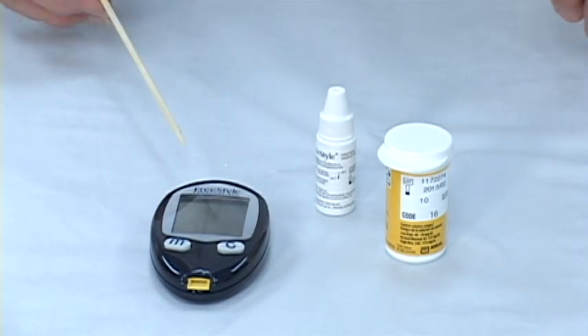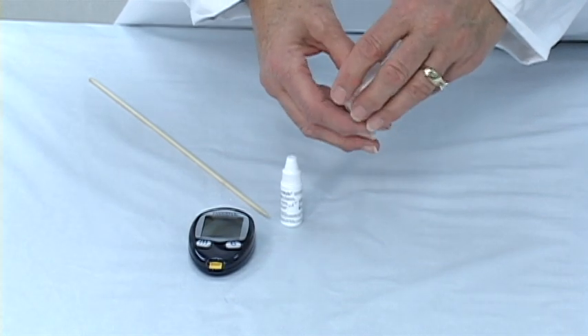You should use the glucose control solution that came with your meter whenever you open your vial of strips. Strips are very sensitive to temperature and moisture, so if you find that you left your strip vial open, you need to test with the glucose control solution. And if your blood sugar readings are not where they have been for the past few times, then use the glucose control solution.